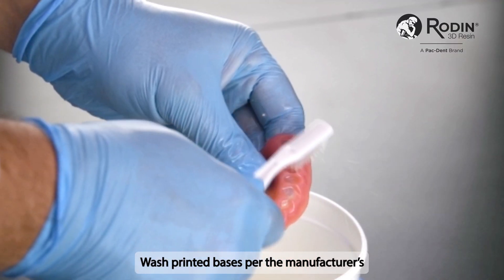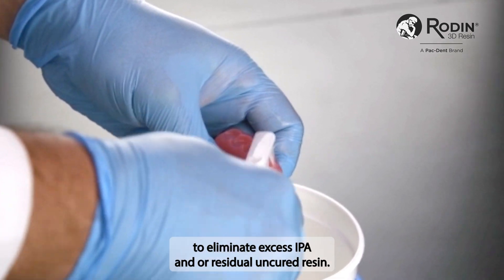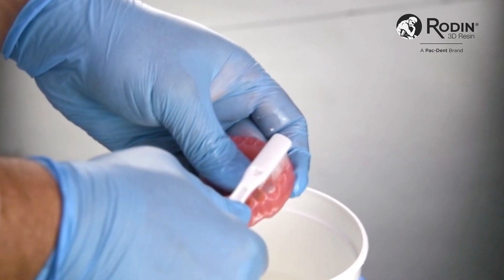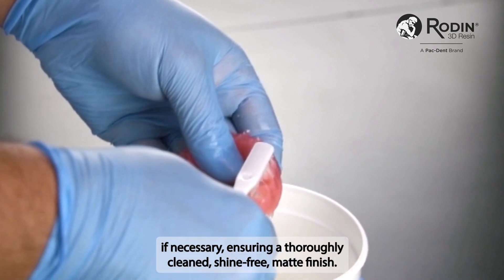Wash printed bases per the manufacturer's IFU using compressed air to eliminate excess IPA and/or residual uncured resin. Repeat the cleaning process if necessary, ensuring a thoroughly cleaned, shine-free, matte finish.